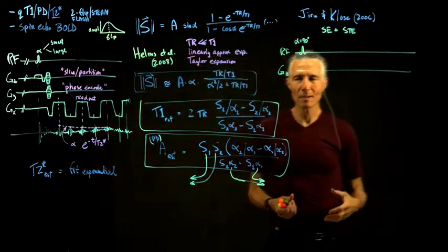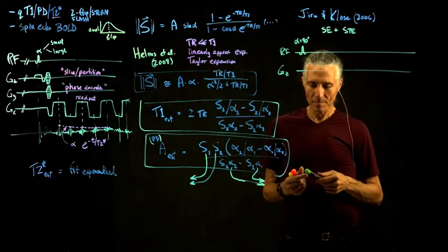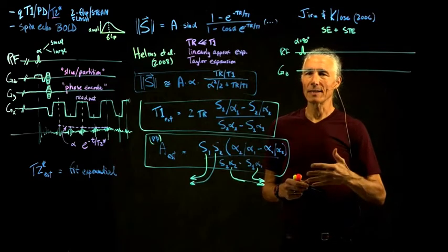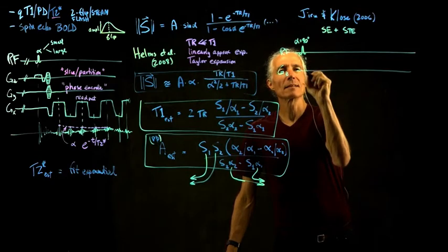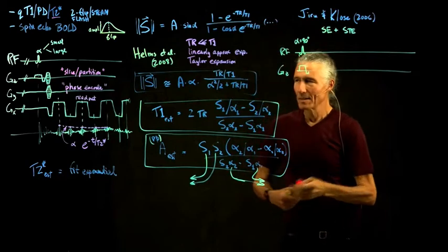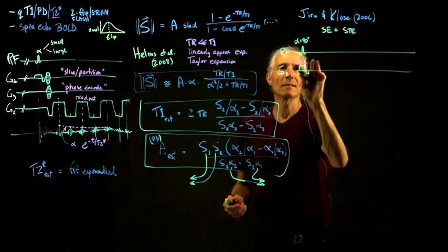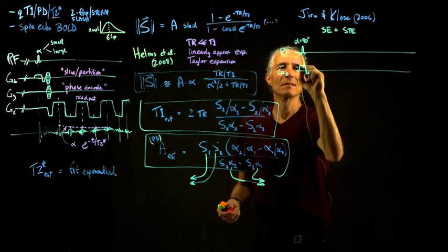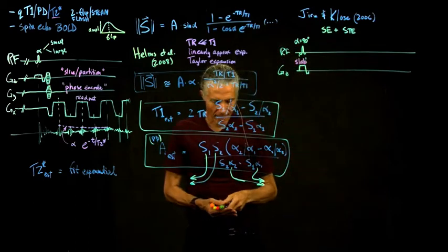So we're doing something like echo planar, but we're collecting a whole volume instead of just a single slice. So this is a slab select. It looks like a slice select, but it's a slab. I said slice. Okay, slab. So it collects a whole slab of data.